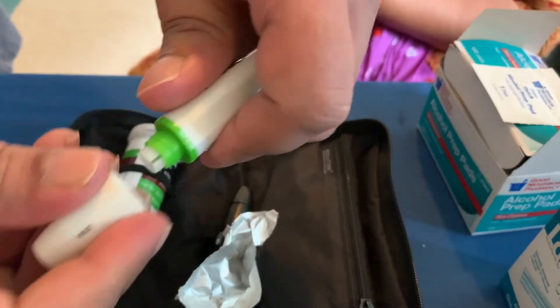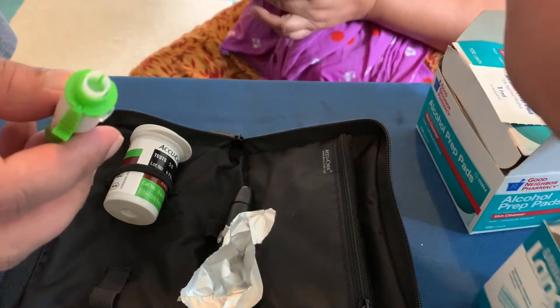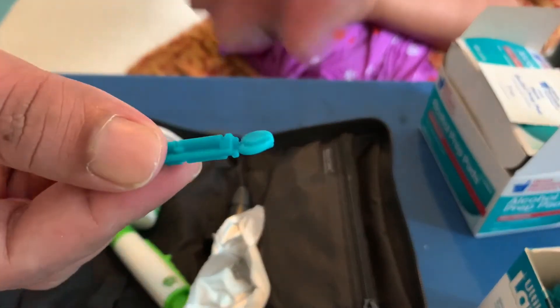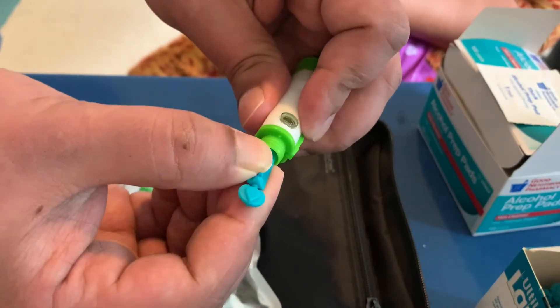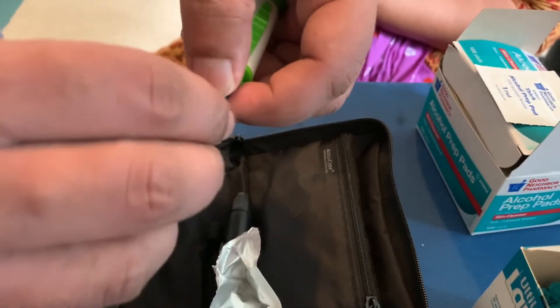Open it. Now you want to insert a lancet into it. This is how the lancet looks like — you put it inside the needle. Now you have to get rid of the top, just like this.